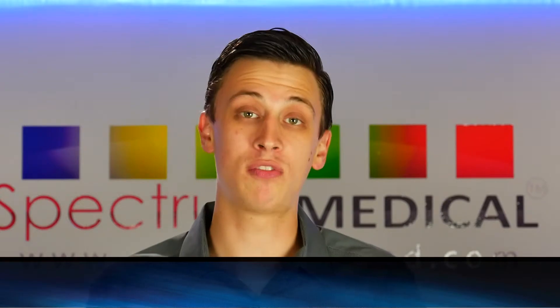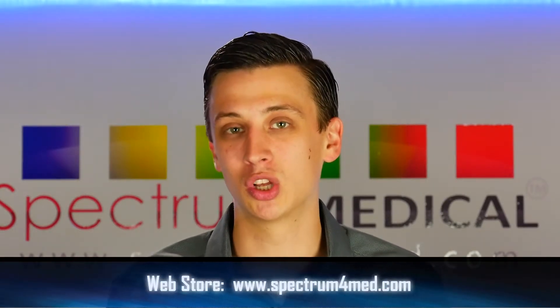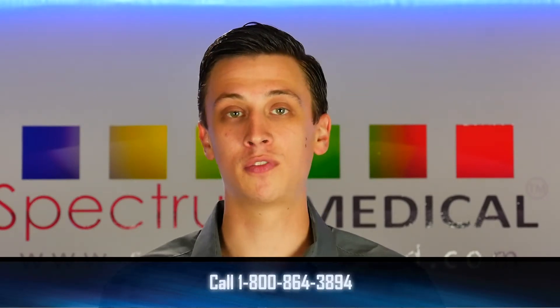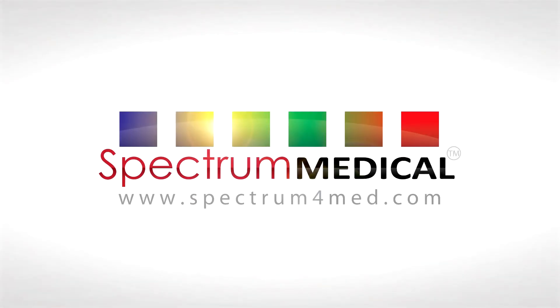To recap, if you're looking for a therapeutic ultrasound unit that's small and durable but also has all the features of a clinical device, the Dynatron 125 is a good one to look at. It comes with a one-year warranty straight from the manufacturer, and Spectrum Medical is going to be here to support you for the future. If you ever need parts or service, give us a call — we'll get you taken care of. To order online, view product information, or obtain service, visit Spectrum4Med.com.